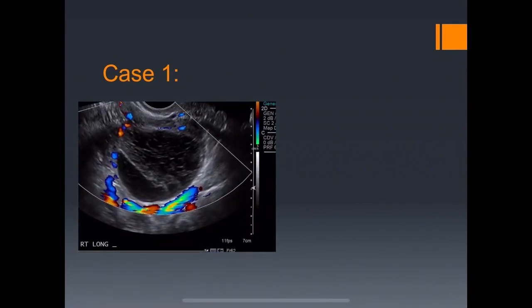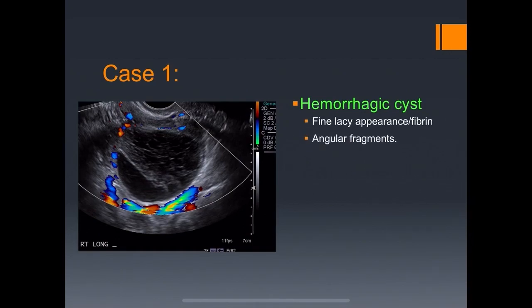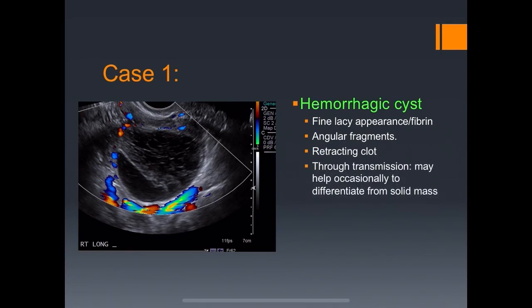Case one: right adnexal pain. This is typical of a hemorrhagic cyst — it has a lacy appearance with angular fragments and lines, consistent with a retracting clot. Through-transmission may help differentiate this from solid masses. It usually resolves in 6 to 12 weeks but can lead to ovarian torsion if large enough.